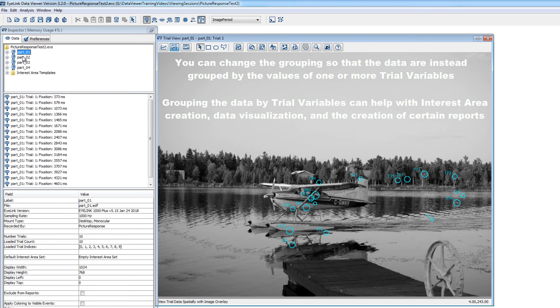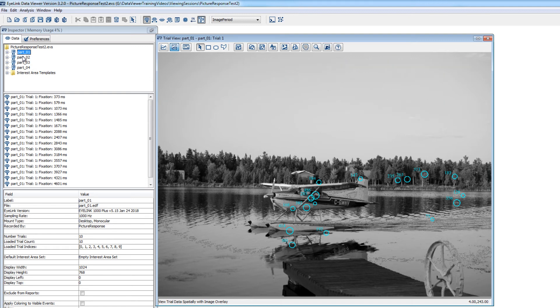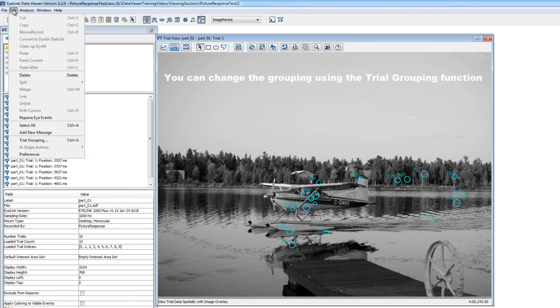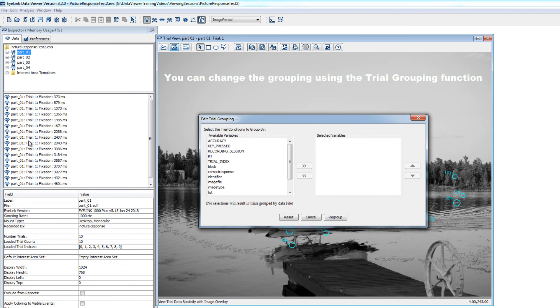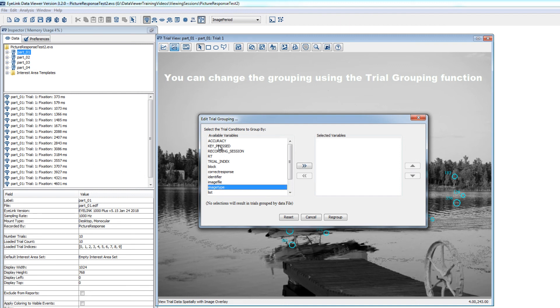To change the grouping of the data, you can go to the Edit menu and then click on Trial Grouping. From here, you can select which variables to use as grouping variables, and use the arrow to move them to the Selected Variables box. You can group by as many variables as you like. I'll select a couple of variables here, which coded the condition of each trial and the accuracy of a button press response for the trial.